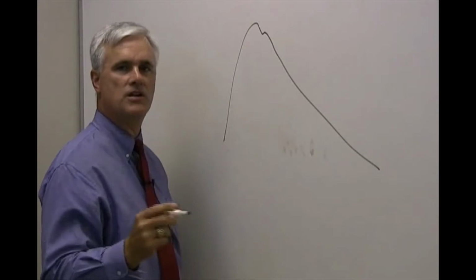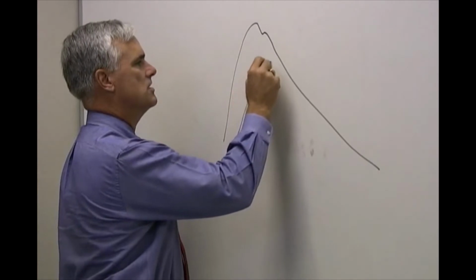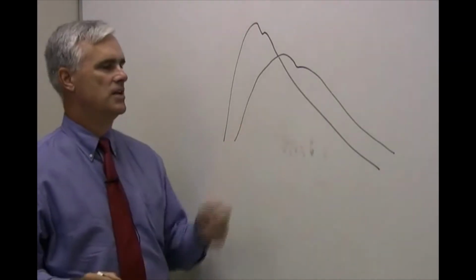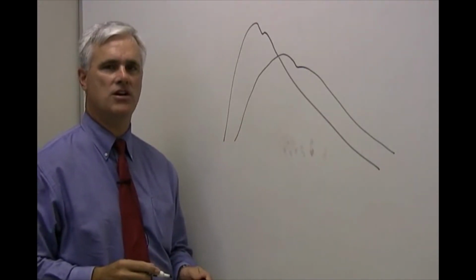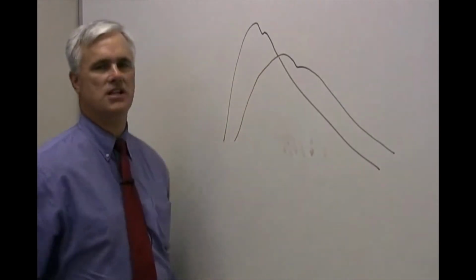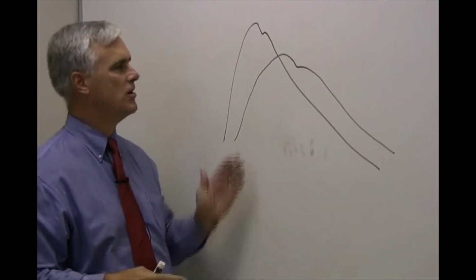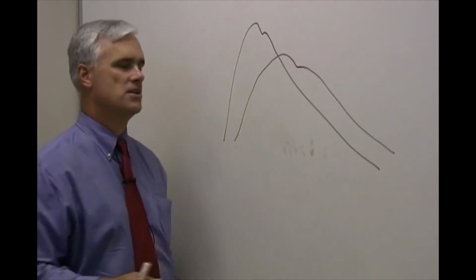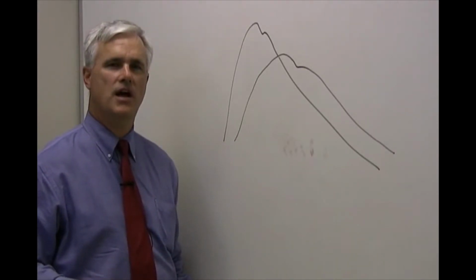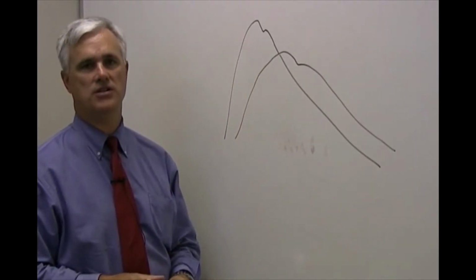The first pulse that we're going to show you on Harvey when you have a chance to practice is one that is slow and late. So in Latin, that's a parvus et tardus pulse, and that occurs with aortic stenosis. If you want to know that the pulse is late, then you can listen down at the apex, and the heart tones are occurring well before the pulse is. It also just feels like it's coming up slowly underneath your fingers, and there's not much of a pulse that you're feeling. So that's a parvus et tardus pulse, which goes along with aortic stenosis.